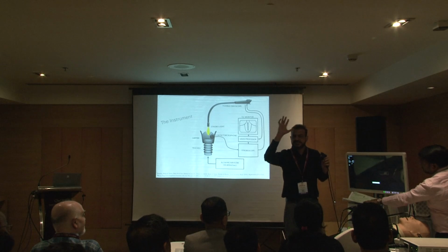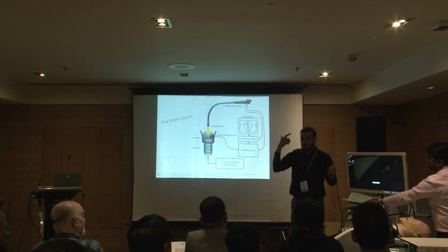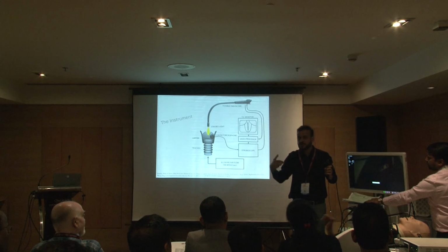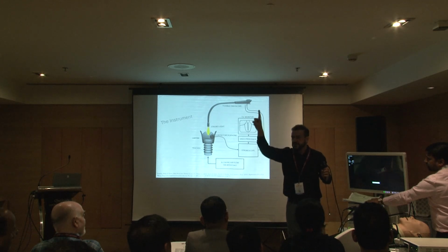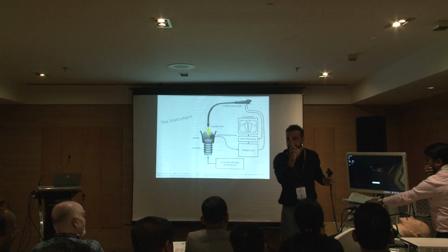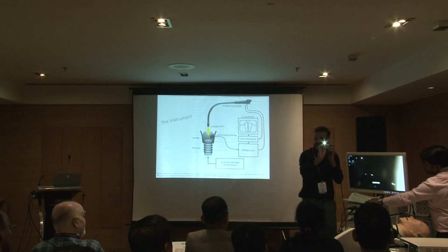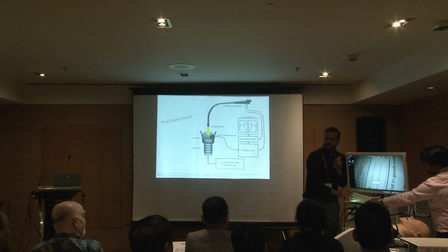It is just like watching a film. Do you want to watch a film from the front row or the last row? All of you want to watch from the last row because you get the entire view of the screen. I can watch the film from the front row also, but I have to look very carefully and I will not be able to see it. That effect is there. My eye is very, very close to that structure, so the vision may not be completely clear or you may miss a few things.